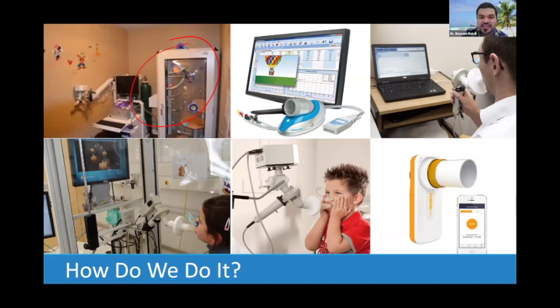This is a kid performing spirometry. We tell them to keep their hands on their cheeks when they do it. Nicely for kids, we usually use special software. So you see in this one, there are candles, and when the kids blow, the candles blow out. This software has a picture of a balloon, so the harder the kid blows, the more the balloon will fly. There are a lot of different software packages and also equipment.